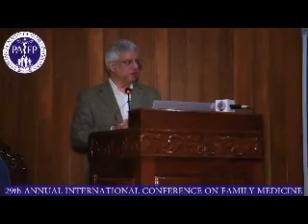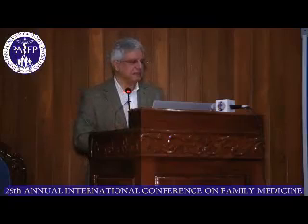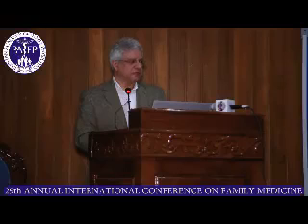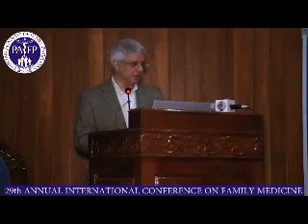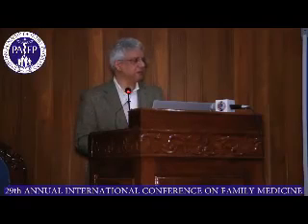One thing more which is relevant over here, with the advances in technology, the comeback for CT is based on the spatial resolution it can offer. The spatial resolution of CT still is far exceeding what we can get from our standard MRs unless we acquire volumes. Volumes can bring it down.